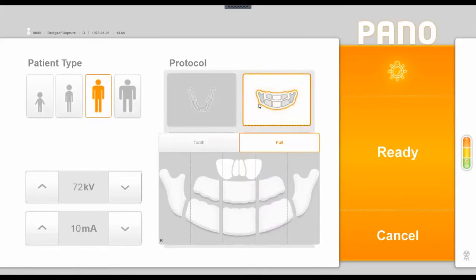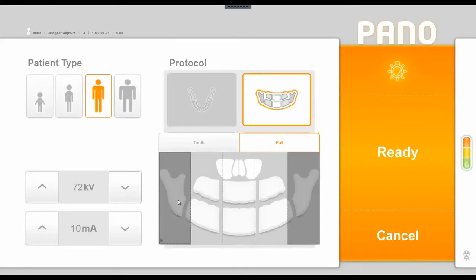The option to the right gives you the ability to do segmented panoramic images. By clicking this icon, you have a slightly different interface that lets you select or deselect areas that you'd like to have imaged. So if you did not need the TMJ in this image, we could gray that out. The machine will still do the full rotation around the patient, but it's only going to radiate the areas listed in white rather than gray.